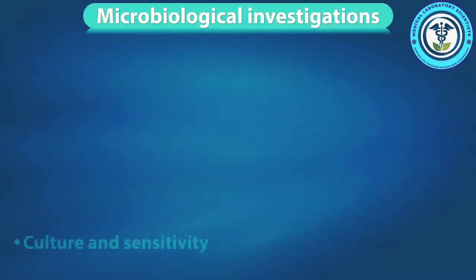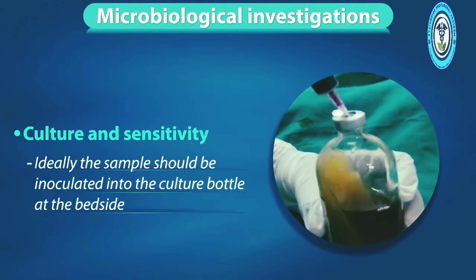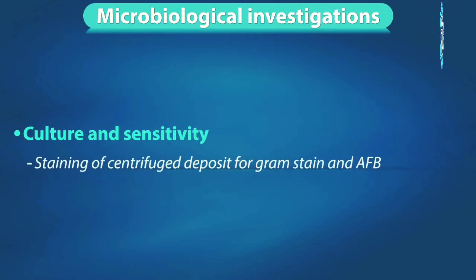Microbiological investigations. Culture and sensitivity. Ideally, the sample should be inoculated into the culture bottle at the bedside. If not possible, it should be processed in the microbiology department in the lab. Staining of the centrifuge deposit for gram stain and acid-fast bacilli is then carried out.